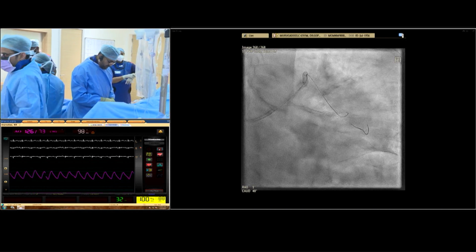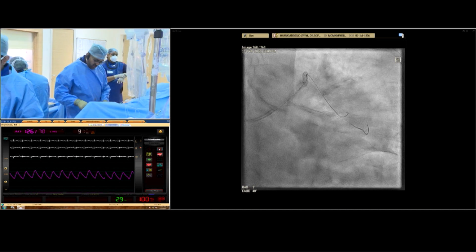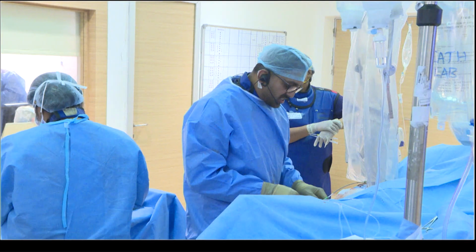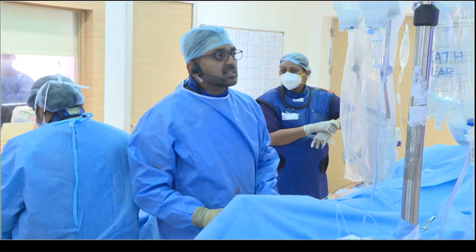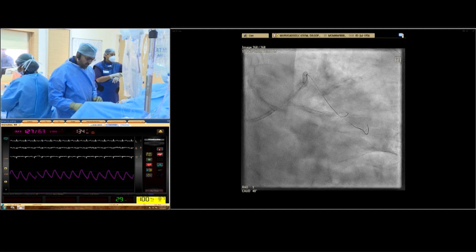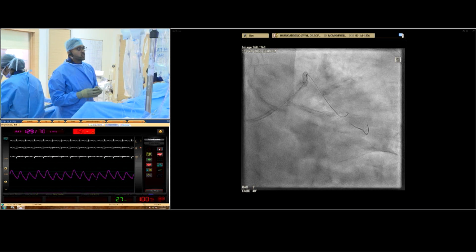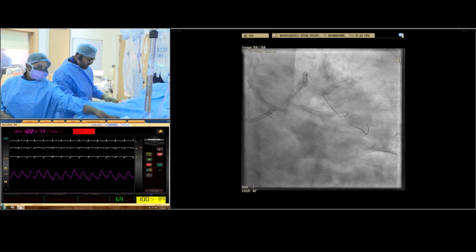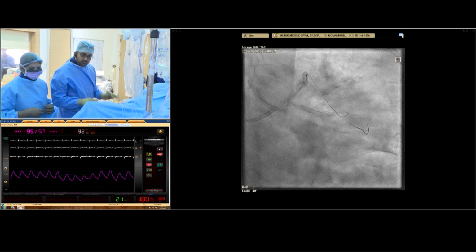And one of the other things is using a new balloon for all the recrosses, because multiple times we have tried to save balloon costs, and we may get lucky, but I think we often dig a hole for ourselves by reusing, and it does not optimize the procedure well. A reused balloon, especially if it's not profiled well, we actually don't know what kind of damage it could lead to as it traverses through unintentional areas.